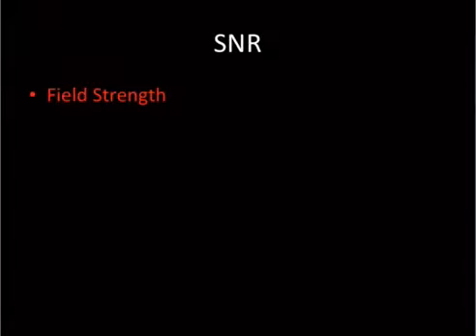Another thing that improves your signal to noise also is a smaller surface coil. That's why it's important to use the right coil. That's why there is a breast coil, or a wrist coil. You wouldn't want to use the body coil on a wrist, those kinds of things. That improves your signal to noise ratio. If you've ever seen the MR tech put the wrong coil on, the images don't look as good.